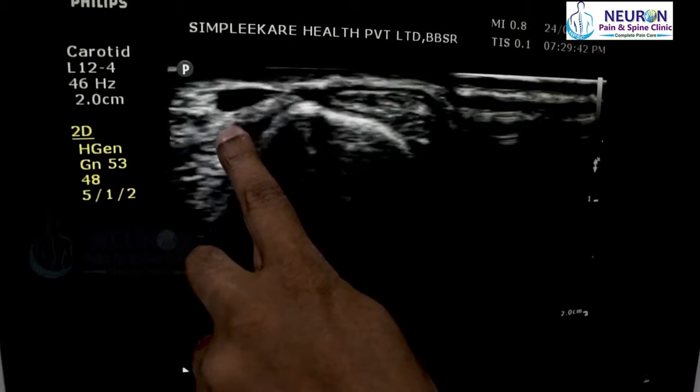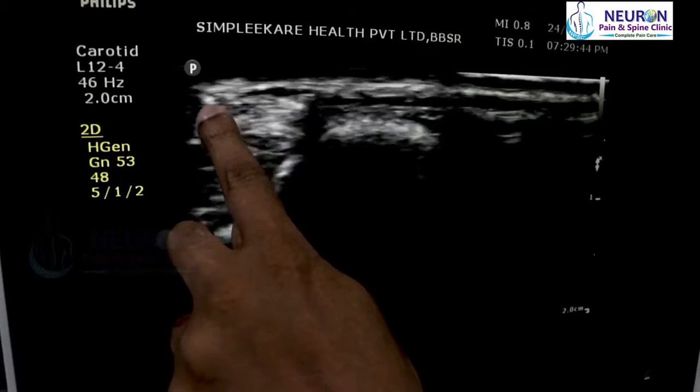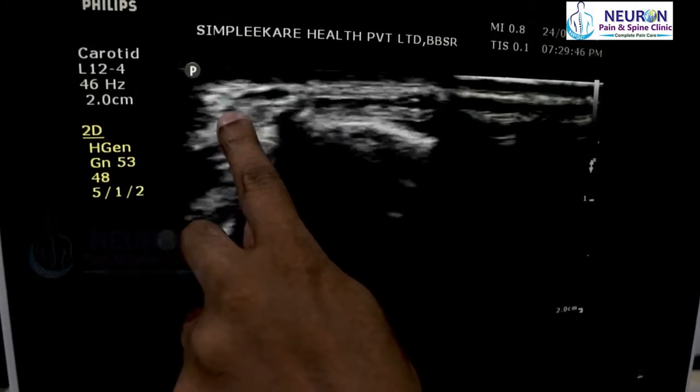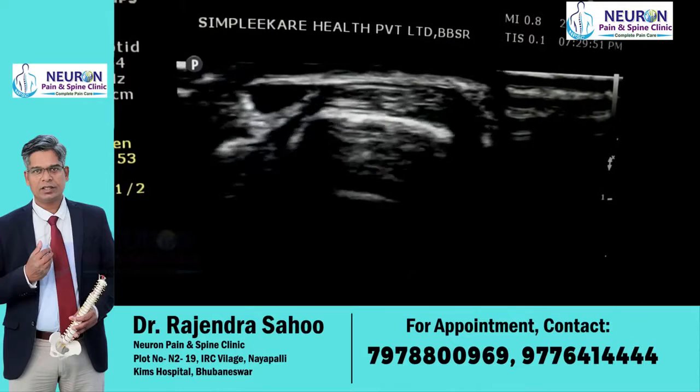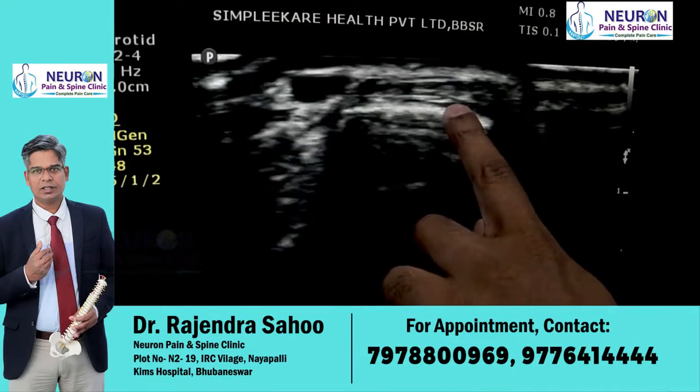Posteriorly, there is a vein that is somewhat compressed. The superficial branch of the radial nerve lies exactly on top of the vein and crosses over it. I will show the superficial radial nerve in a separate video. That completes the first compartment.